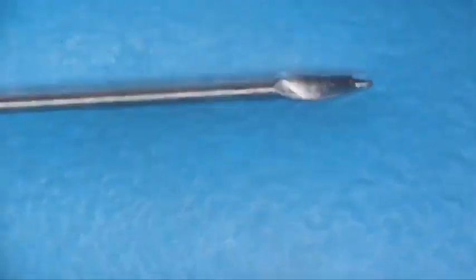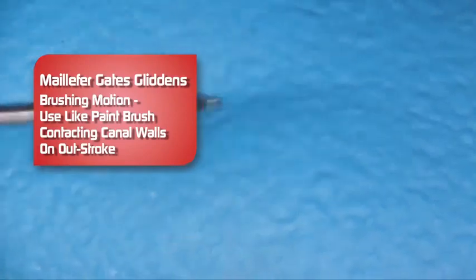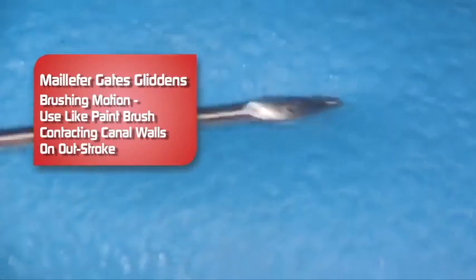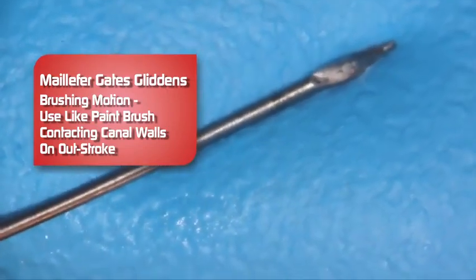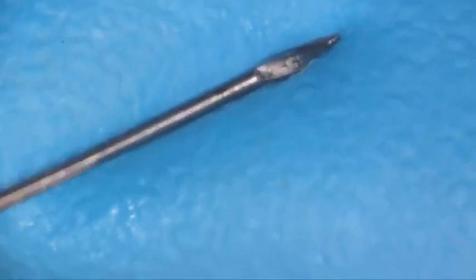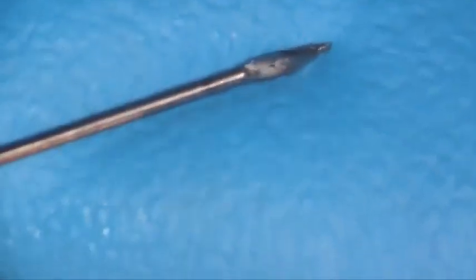When we use a Gates Glidden burr — and this happens to be a number two — we use it like a paintbrush. Just a very gentle motion here to clean off the sides. The Gates Gliddens are pretty flexible; as you get up in size, they get a little bit stiffer. As we go up in size, we want to move more coronally in the canal. It is a nice way to clean out the coronal portion of the canal.